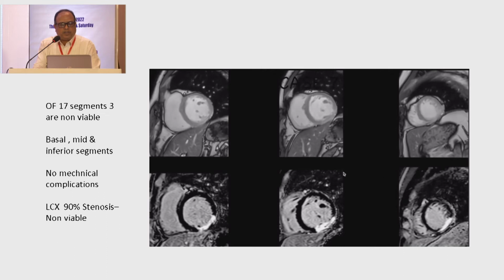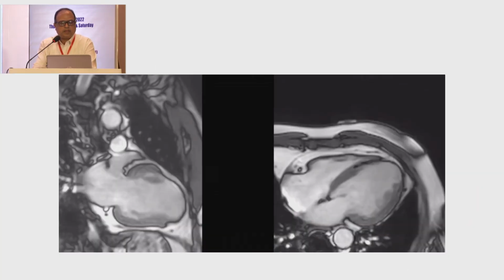And the corresponding segment shows the white transmural thickness of the LCX territory. So whatever the stenosis of the LCX, it is not viable.